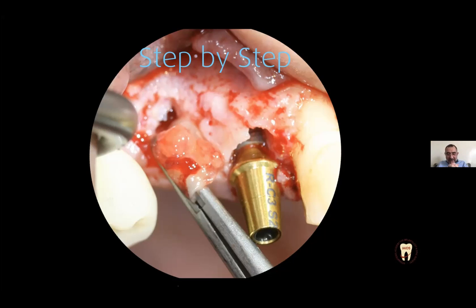This is the question. Do we stop our surgery in these circumstances or not? I never stop my surgery in this circumstance. But I know that I have to put a maximum of PRF and CGF into my sinus, and I avoid putting bone grafting if I know that I perforated my sinus.